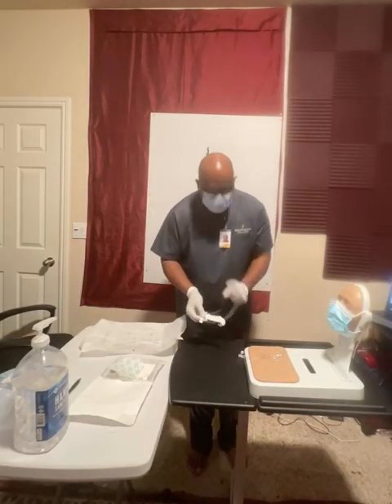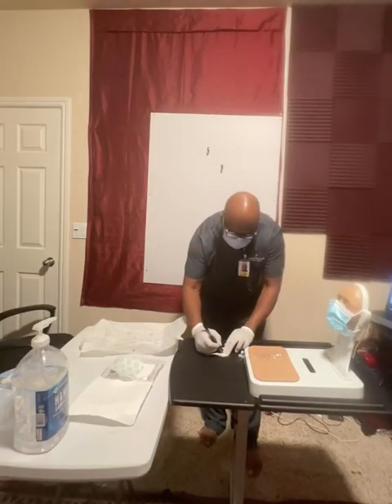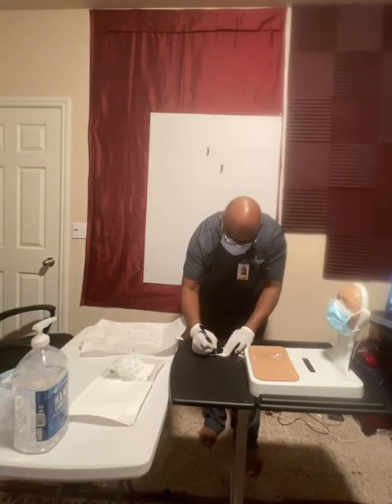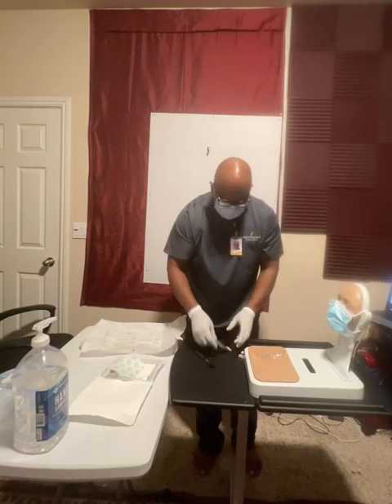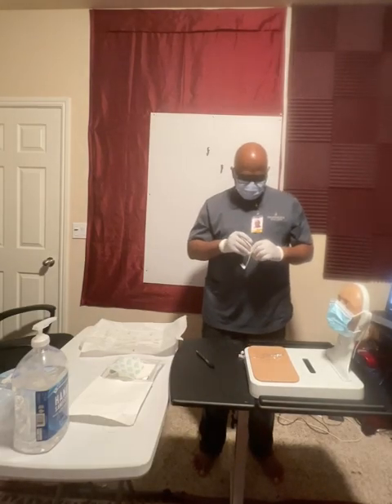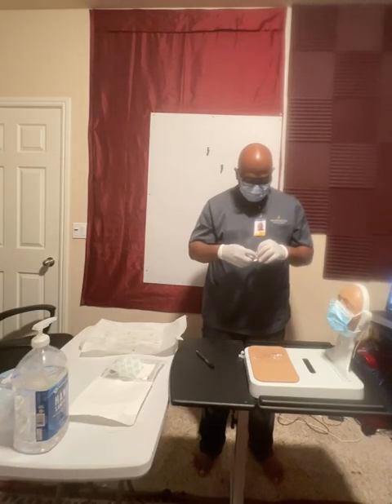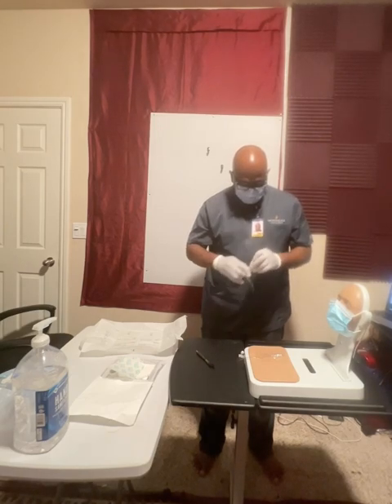Now, with the side that has the tape, I'm going to use this disposable pen. I am going to put today's date and the time, also my initials. The reason for that is so that we can keep a form of team communication, so the next person who comes on knows when this was placed. And due to our facility policy, we're going to follow that on when it needs to be changed.